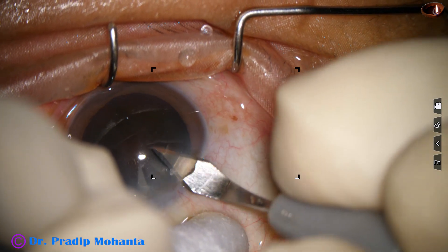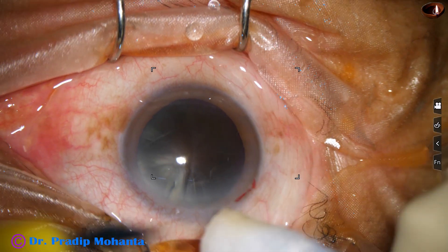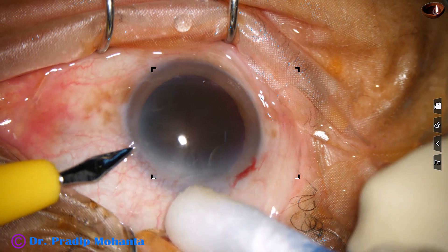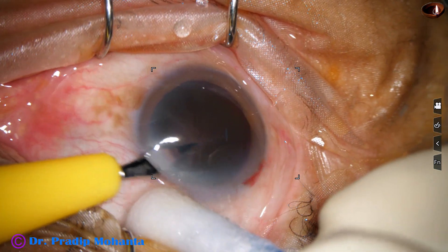This is the main incision with a 2.8 mm steel keratome on the posterior aspect of the limbus. And this is a side port about 3 o'clock hours away from the main incision on the left side.